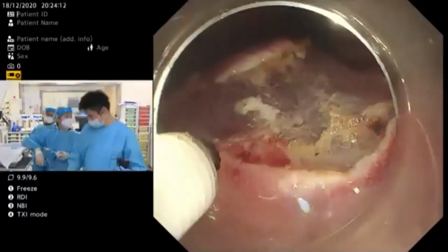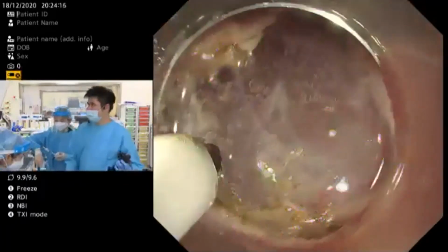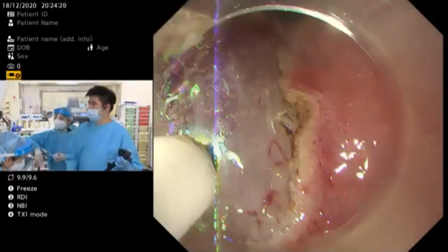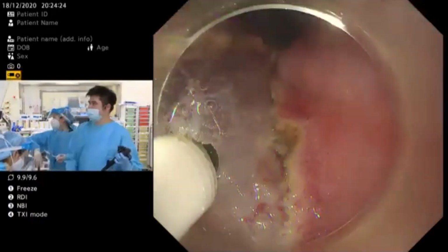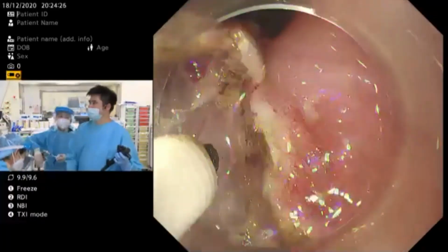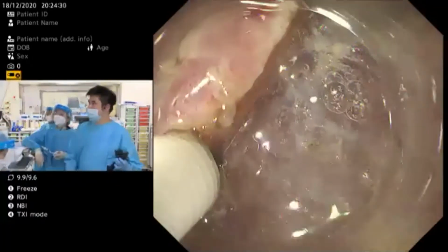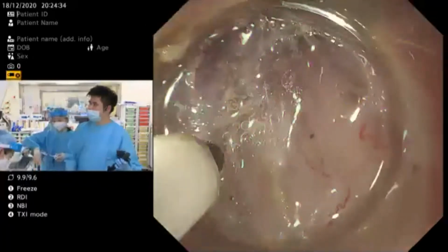So I'll go back to the center, and hopefully I can get to the deeper submucosal plane. So you can already see the underlying muscularis propria layer, but still there's a layer of submucosal tissue, so we can dissect a bit more to expose the muscle.